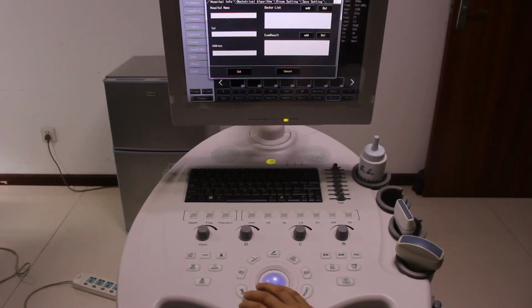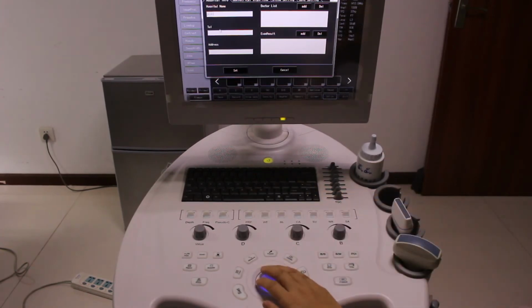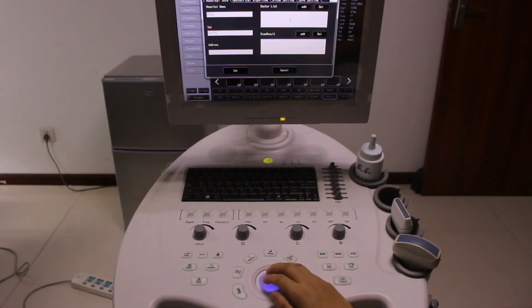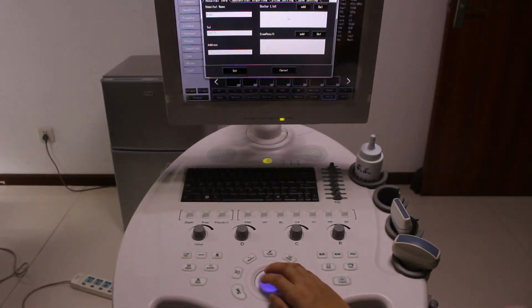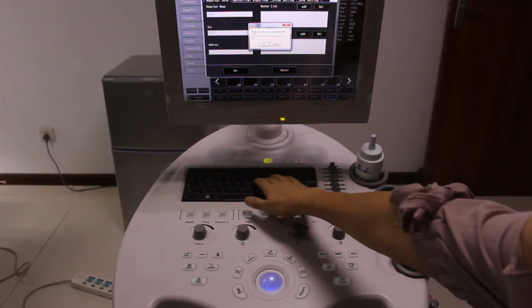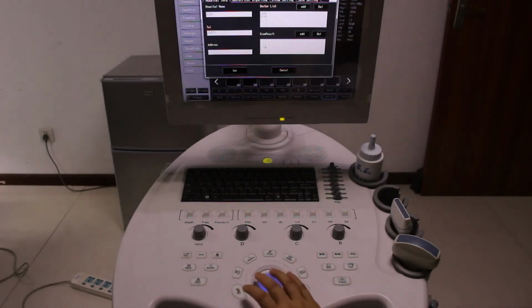Let's say hospital name input and care number. Also, there are many doctors, so you can add a doctor list. This is very useful for improving your efficiency in making a report.